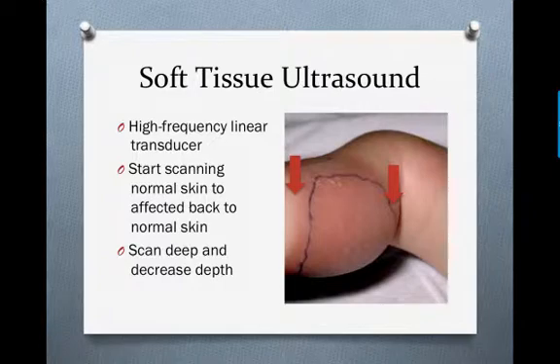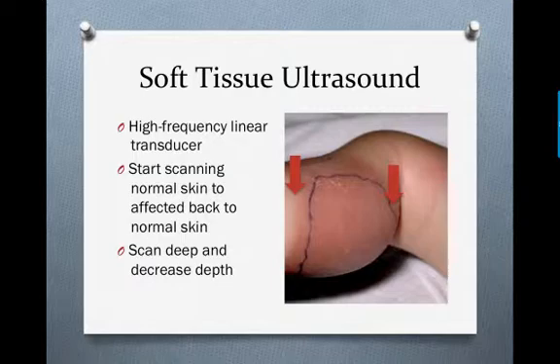We're going to use our high-frequency linear transducer. We're going to start from normal skin, scan over the infected tissue, back to normal skin. You want to do this in both the longitudinal and transverse plane. You also want to make sure to scan deep so that you don't miss any hidden abscesses.